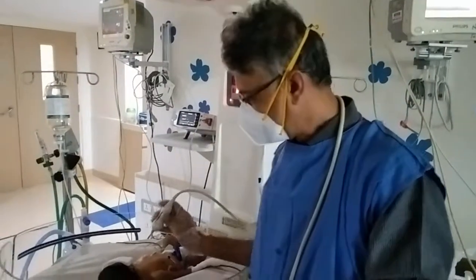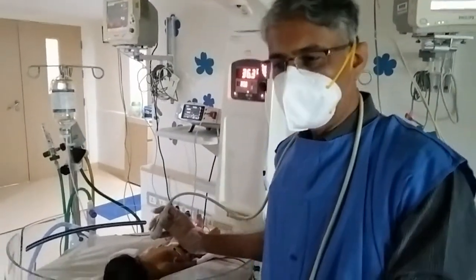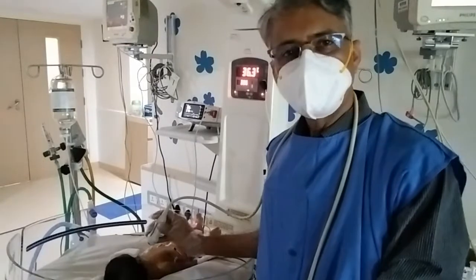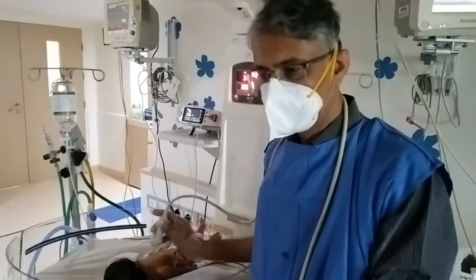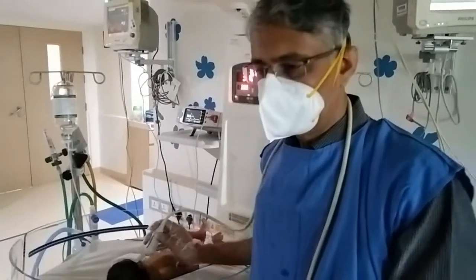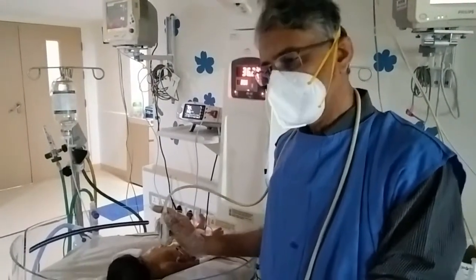I am Dr. Venkatesh, I am a neonatologist. Today I am demonstrating the thymus on ultrasound. Why thymus on ultrasound in neonatology?